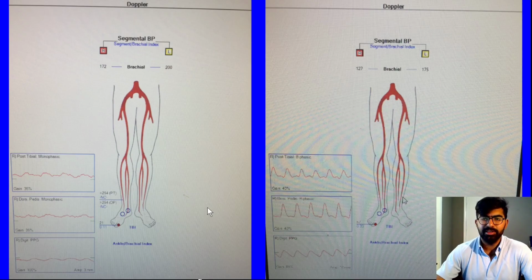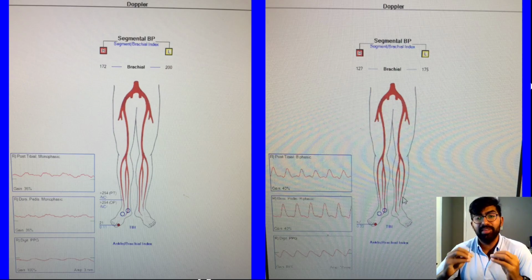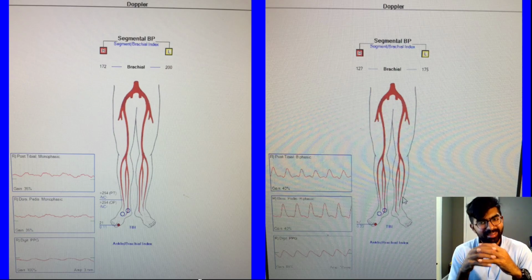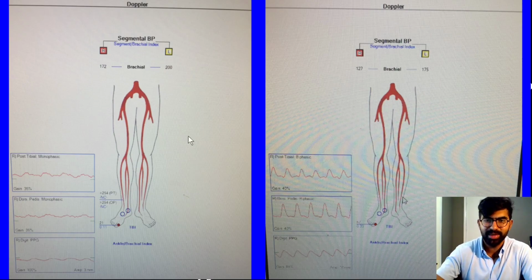And it's not uncommon after these patients with critical limb ischemia get revascularized, the arteries in the legs have had to compensatorily stay vasodilated for so long that they can represent a hyperemic waveform, because it takes them a while to learn that, hey, we don't need all this blood flow, and then constrict back down. Which is what's so beautiful about vascular surgery, because you know that after revascularization for critical limb ischemia, these patients get a lot of edema, and especially if they keep their legs in a dependent position, you're going to have to offer them compression stockings, wrapping, or elevation. But this is beautiful, and it all makes sense, and these waveforms show that concept.